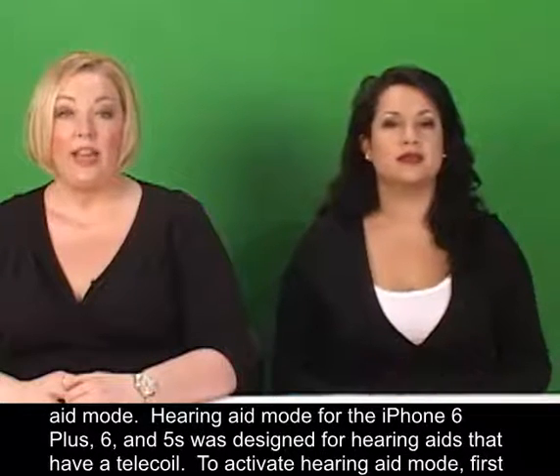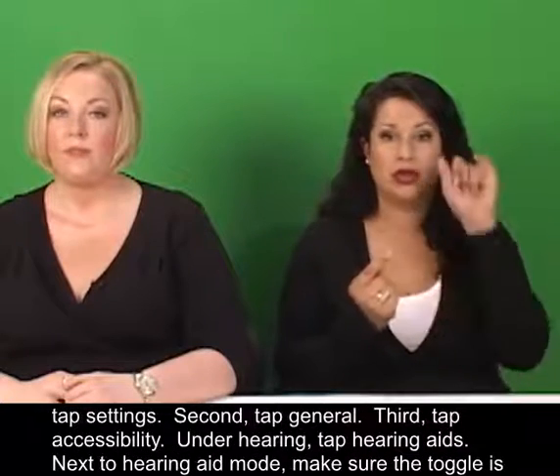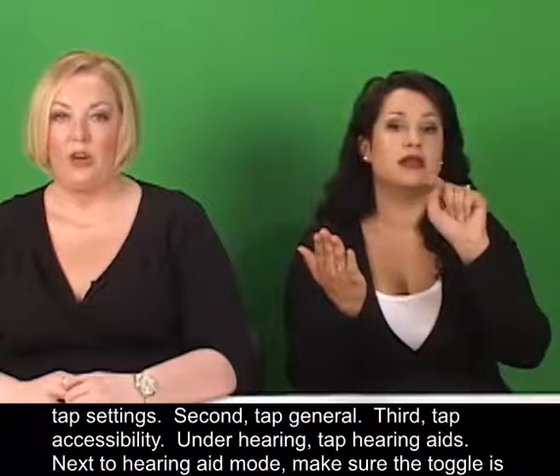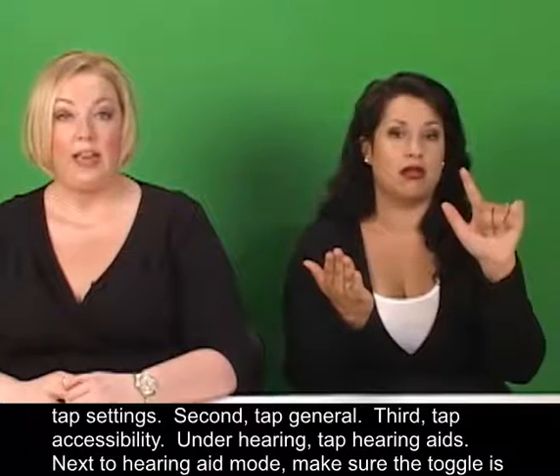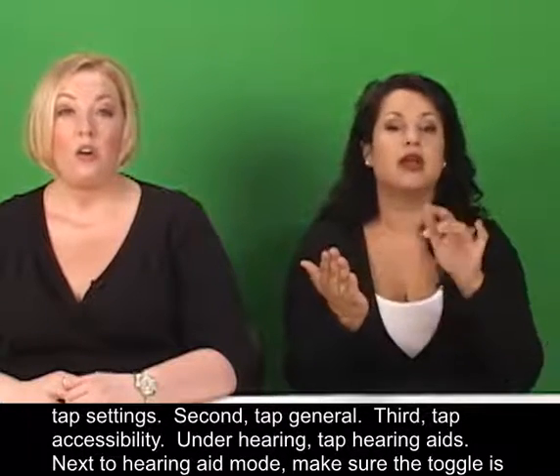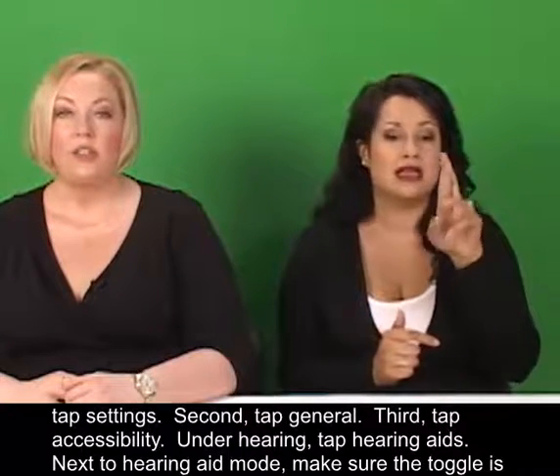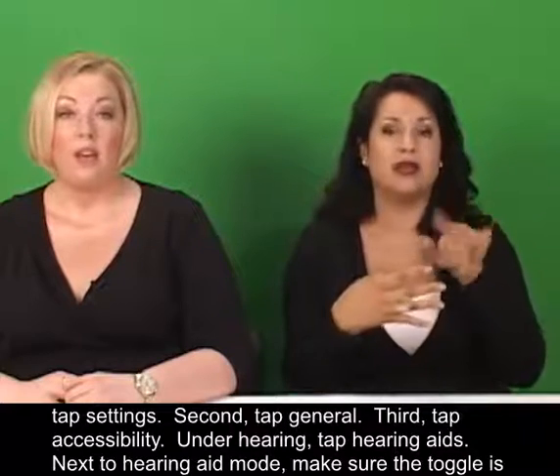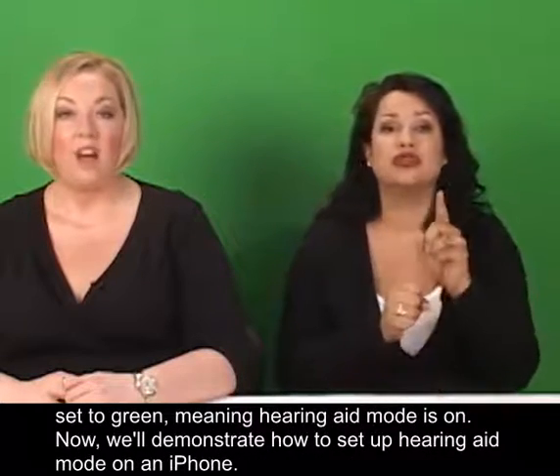To activate hearing aid mode: first, tap Settings; second, tap General; third, tap Accessibility. Under Hearing, tap Hearing Aids. Next to hearing aid mode, make sure the toggle is set to green, meaning hearing aid mode is on.